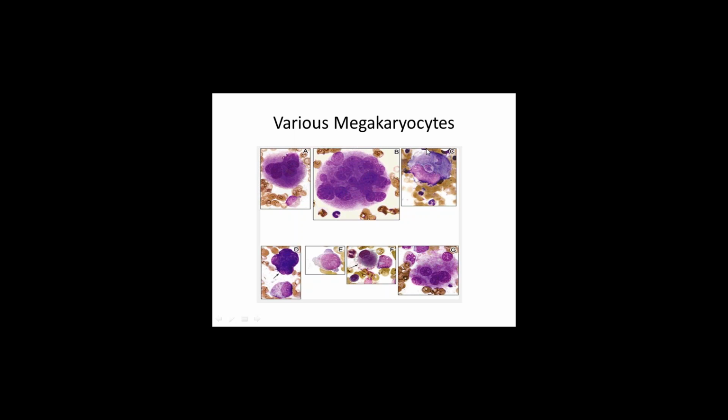presentation of megakaryocyte. Here we can see a classical emperipolysis. It is not uncommon, we can see it many times. An intact cell inside the cytoplasm of a megakaryocyte. And while making a smear, if our hands are very hard, then we can push off this cytoplasm, and what we get here is a bare nucleus of a megakaryocyte.